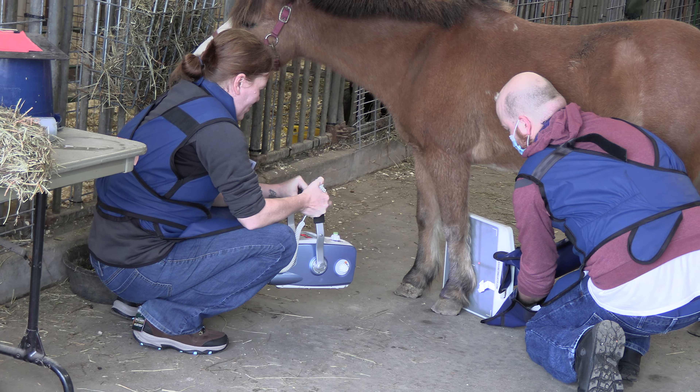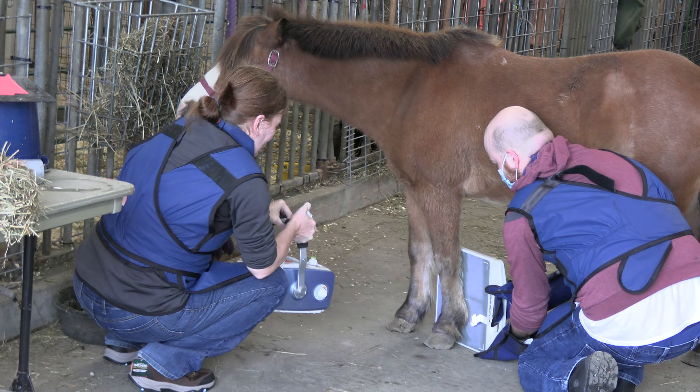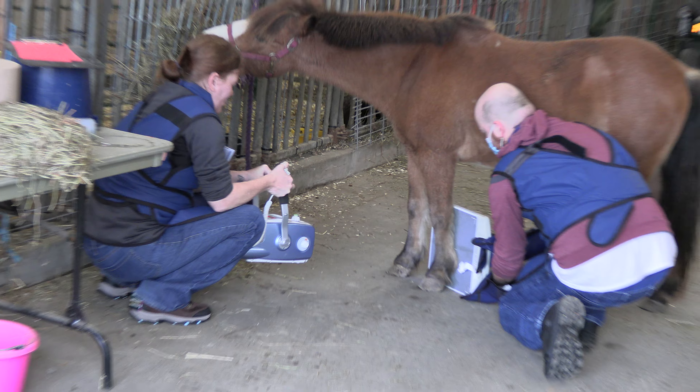Make them match up on the — yeah, exactly, good. And then maybe come back just a little bit so that your whole exposure is in there.